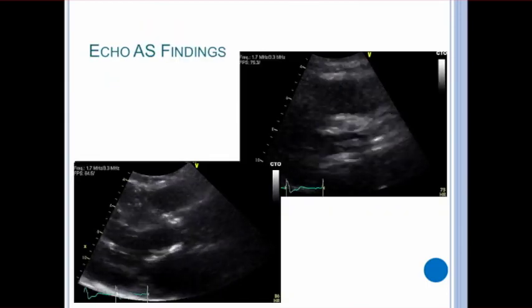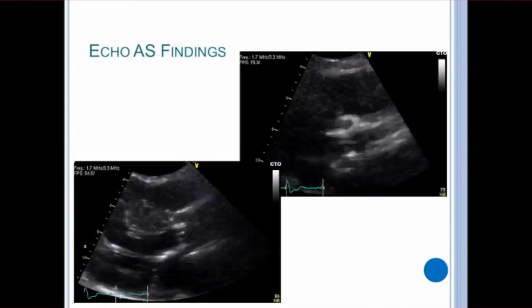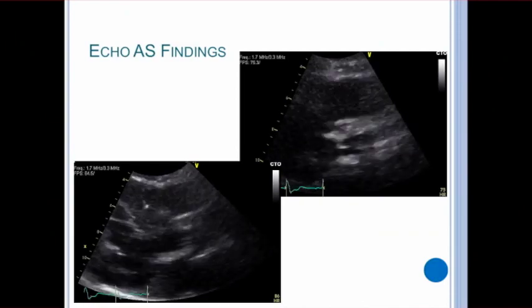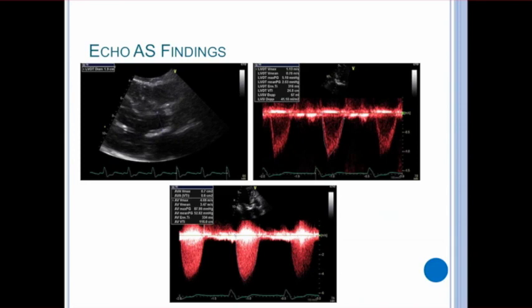Here is an example of a patient with a severely calcified tri-leaflet aortic valve and fair imaging windows. According to the measurements obtained by the sonographer, the patient meets all the criteria for severe aortic stenosis, with a peak velocity of 4.7 meters per second, mean gradient of 53 millimeters of mercury, an aortic valve area of 0.58 centimeters squared, and a dimensionless index of 0.21.